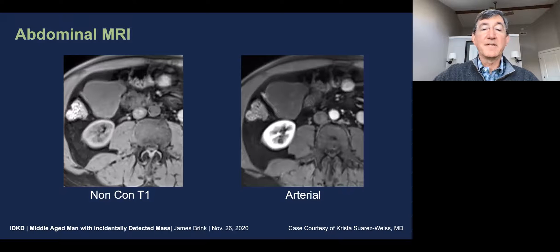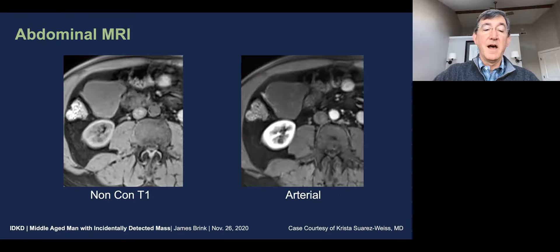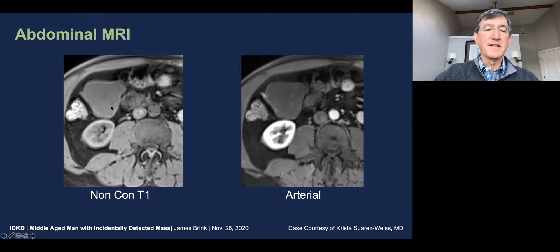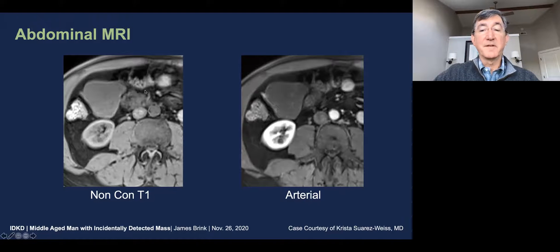Here we have transaxial images from the non-contrast enhanced T1 weighted sequence and a corresponding arterial phase sequence. On the non-contrast enhanced image, we see the mass has a rather unusual shape and is primarily homogeneous in signal intensity, although with some mild heterogeneity as well. It is slightly hypo-intense overall compared to musculature.